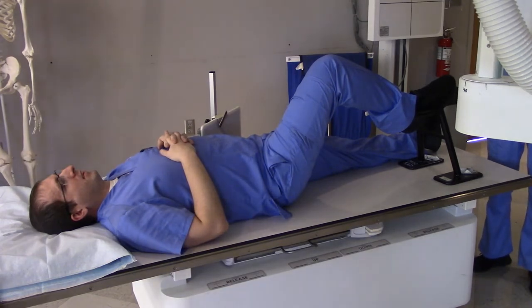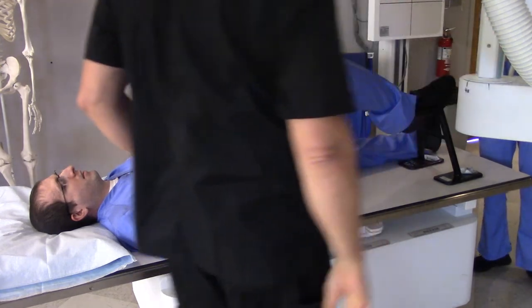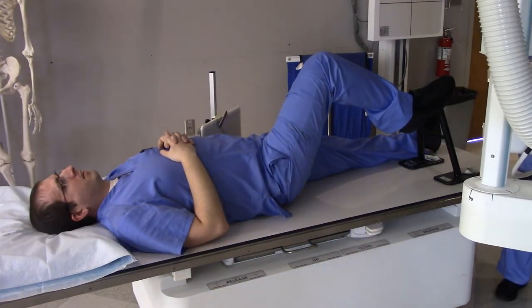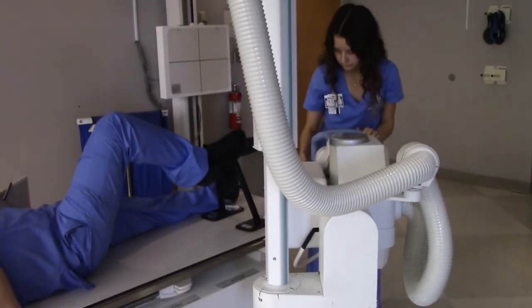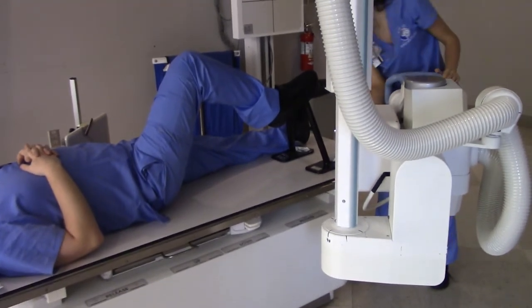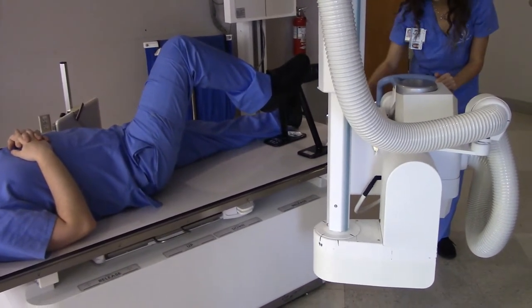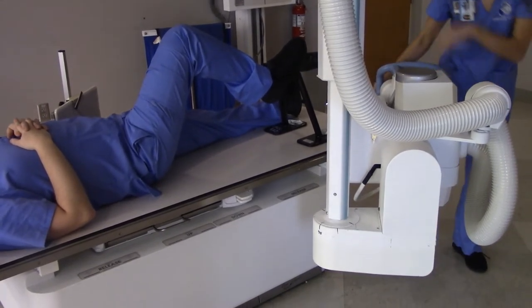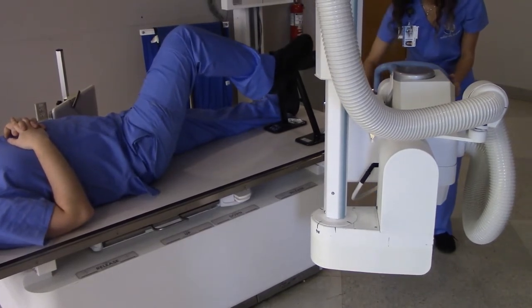If you push the purple button, then it should click in at 45 degrees. There it goes. What side are you at, Evan? That might be as close as you can get. Are you against the table? Yeah.